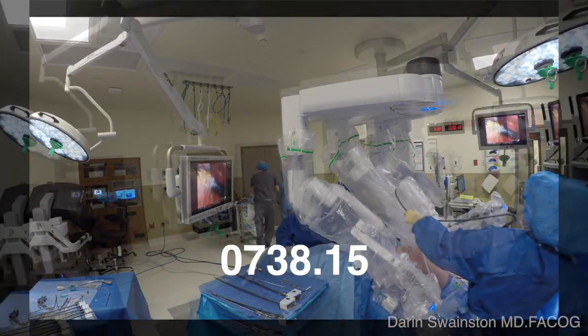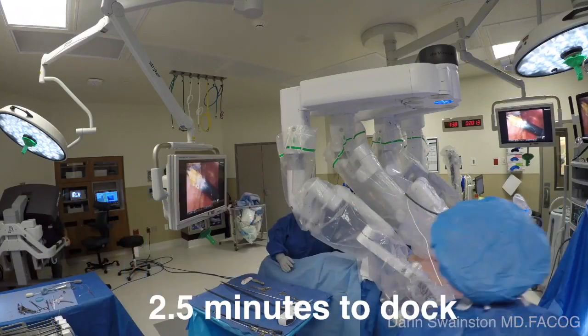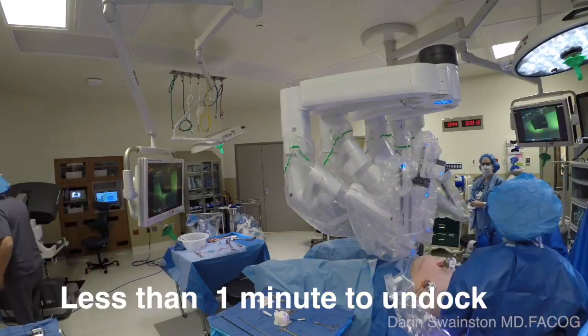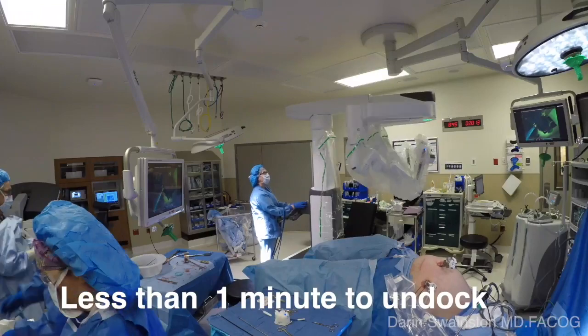Now watch at the end of this case — it's even less than one minute. I barely have enough time to wash my hands and put a gown on, and they already have this robot out of the way. I haven't even been tied up by the time I get to the patient. That's how quickly it happens.